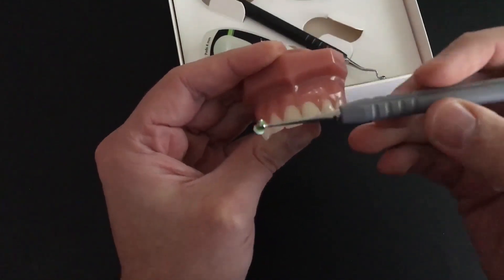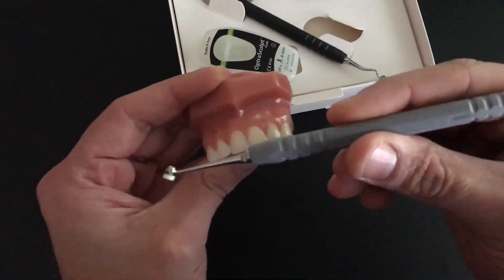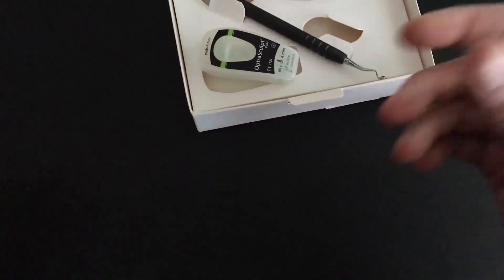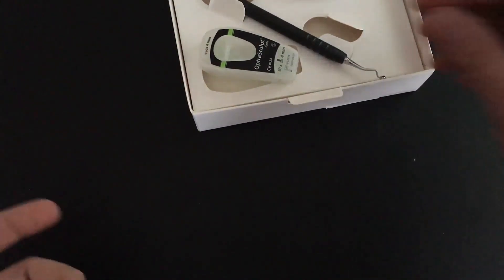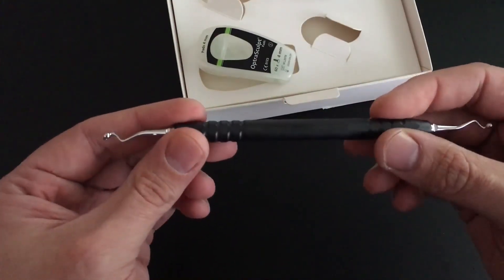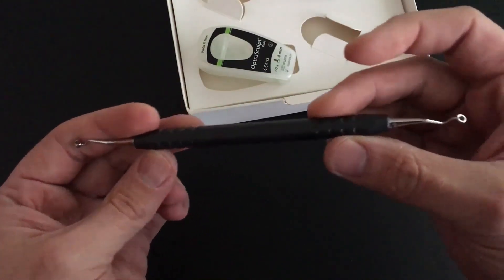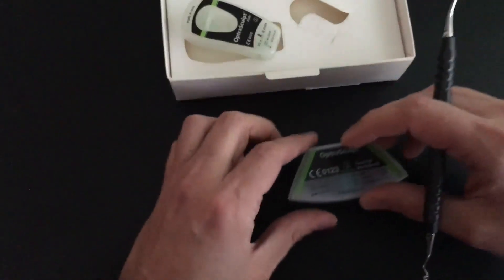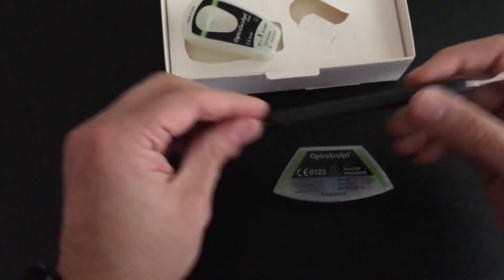This is a really go-to instrument for me for anterior composites, and it's been out for a couple of years — we've reviewed it for DE before and for the Product Navigator Newsletter. What's new, though, is this instrument, which is the same idea but for posterior teeth. Our needs for sculpting composite on posterior teeth are not going to be the same as they are for anterior teeth.